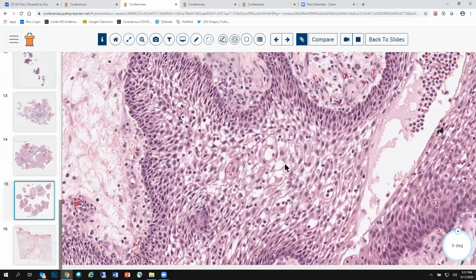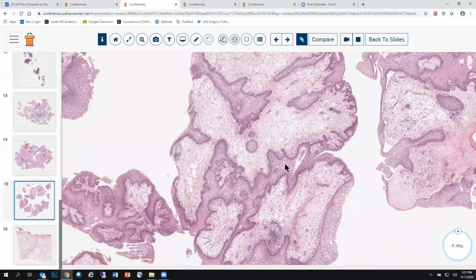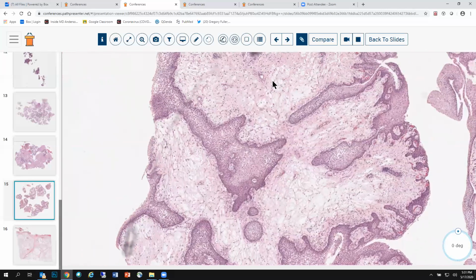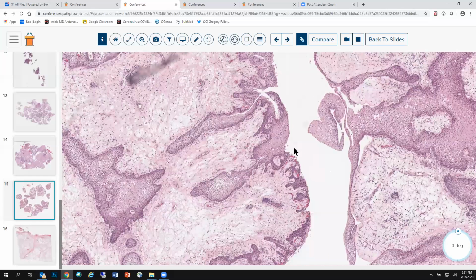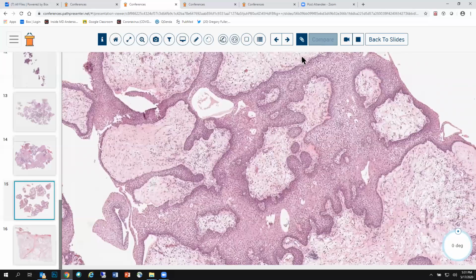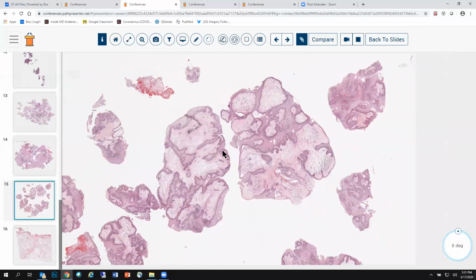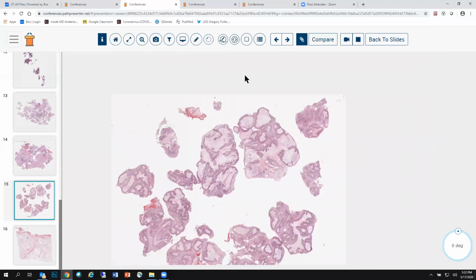What did we say was the morphologic hallmark of adamantinomatous? The wet keratin nodules. There is no keratin in the specimen. All you see is non-keratinizing squamous epithelium and then all these fibrovascular islands in between, multiple nodules. And of course, you could run BRAF V600E, which would be positive, diffusely positive and cytoplasmic, and you should see no intranuclear beta-catenin translocation in papillary craniopharyngioma.